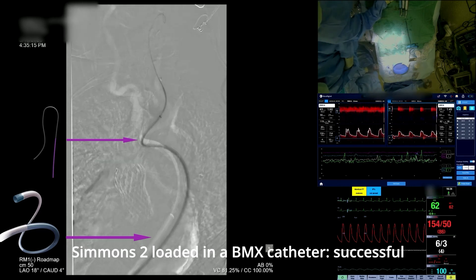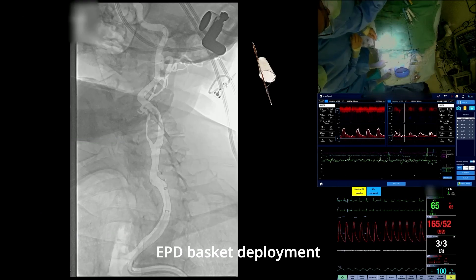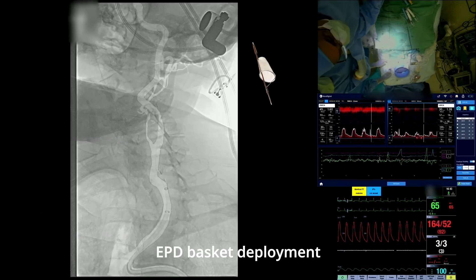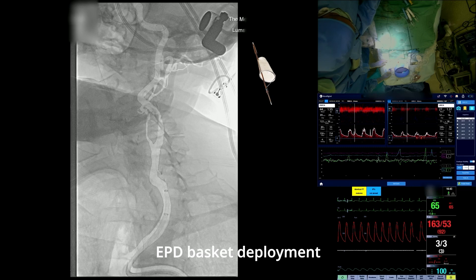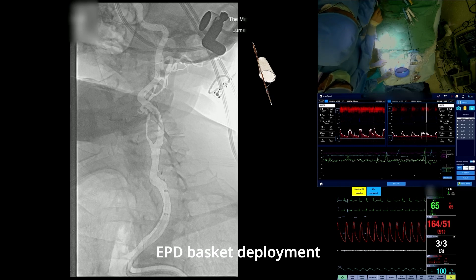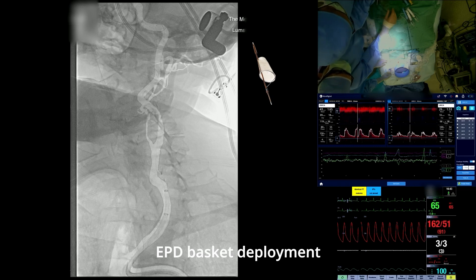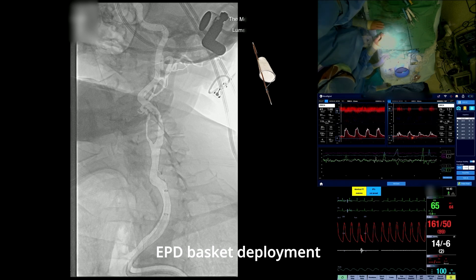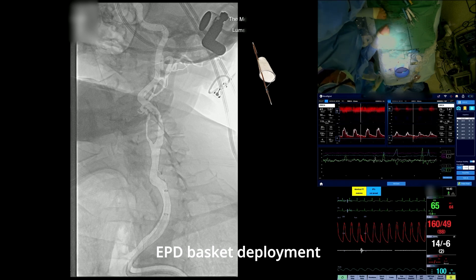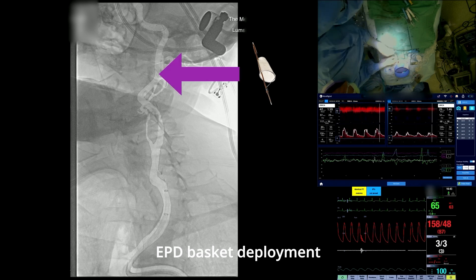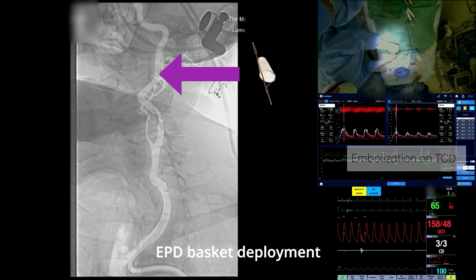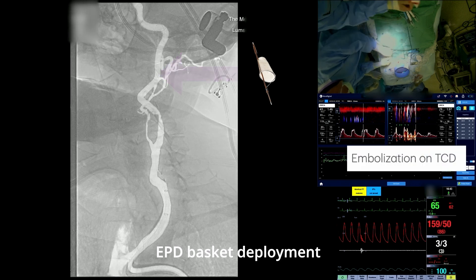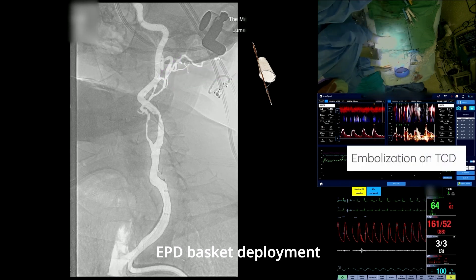The Simmons catheter was then removed, and a monorail system filter wire was advanced through the stenosis, resulting in embolization as seen as white hyperintensities on TCD. The filter was then deployed — the filter basket is visible as a ring on fluoroscopy — providing distal protection beyond the lesion.